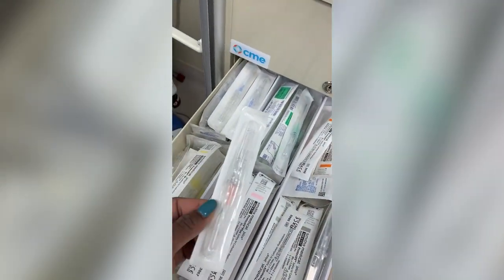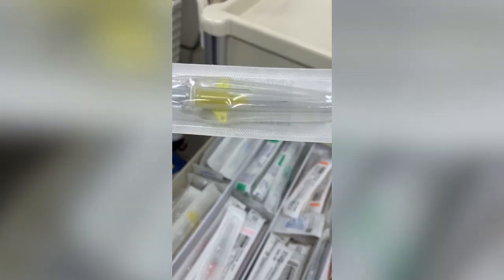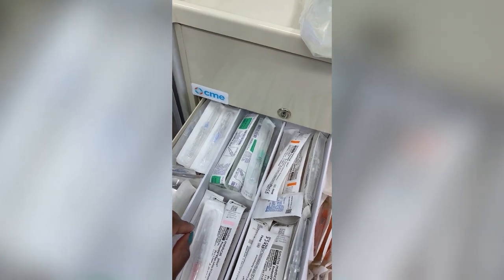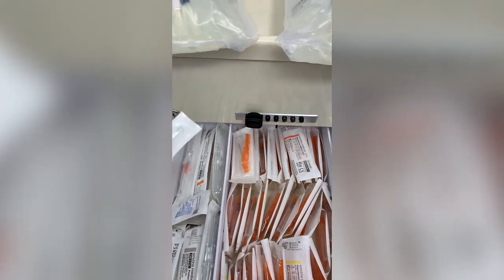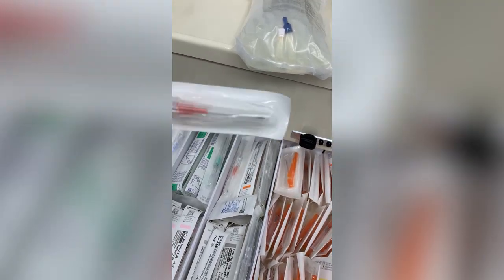IV catheters, we wanna make sure we have enough of those. So those are these guys. It goes from the really teeny tiny ones. This is the baby IV catheter. See how small that is? It's yellow and the tip is very short. All the way up to like the huge whopper, large bore IV. See how big that is? That is big. And we use that on some patients that need a lot of fluid or blood very fast.